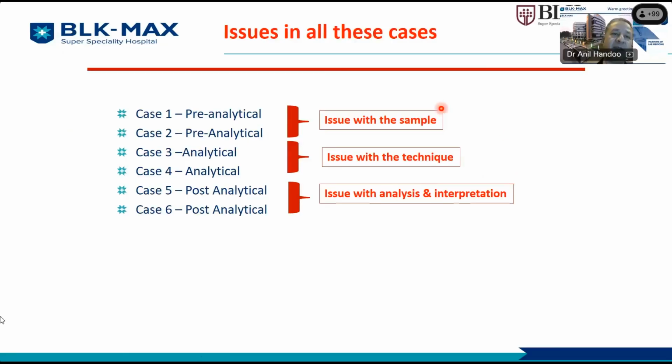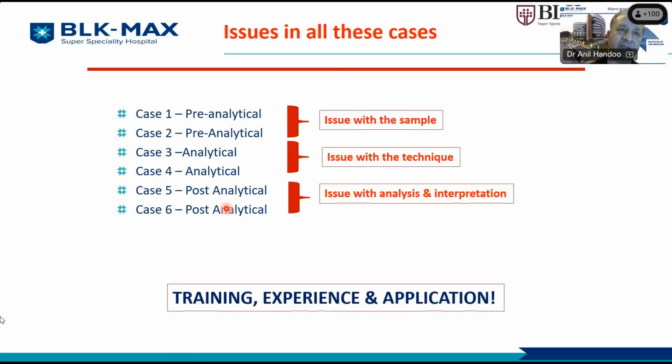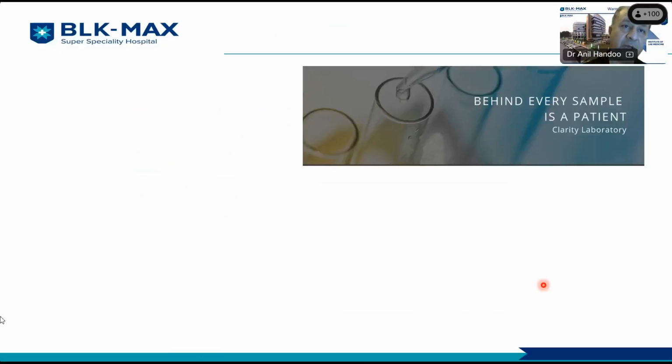So the issues can be there with the sample integrity, with the technique, and with the analysis and interpretation, which is otherwise the pre-analytical phase, the analytical phase, and the post-analytical phase. And to obviate and take care of all this, you need adequate training, experience, and application. So if you understood the whole concept behind these cases, the idea of showing you these cases was to put forth the case for ensuring that quality assurance becomes a part of our routine practices. Now, why do we need to do that? Because behind every sample, there is a patient.